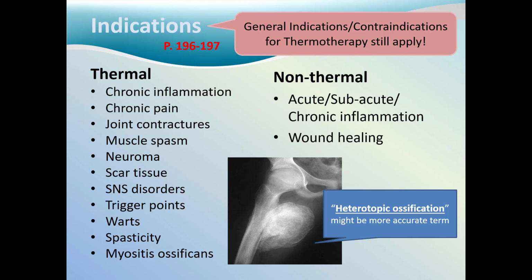The general indications and contraindications for thermotherapy still apply to ultrasound.